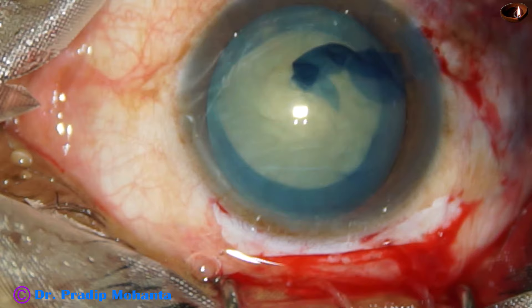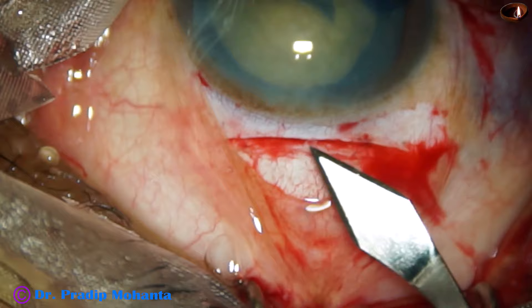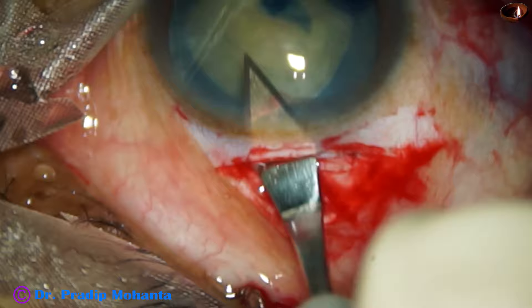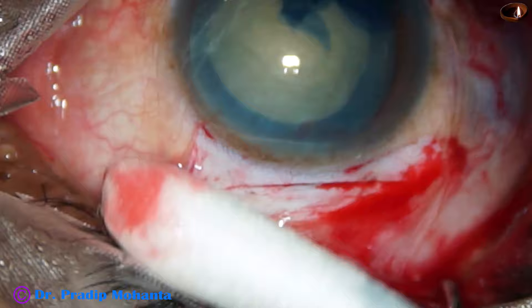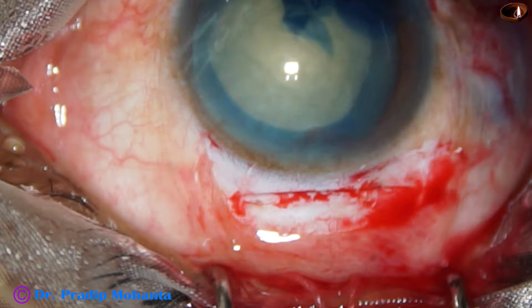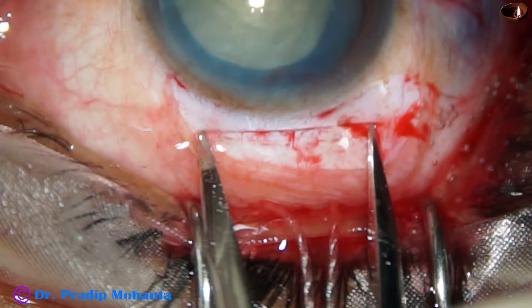Some more viscoelastic is injected and now the tunnel is to be opened. Go to the anterior extreme of the tunnel, then go downward and cut when you go forward. The tunnel is open now. The inner opening is a little larger than the outer opening — the outer opening is about 7 mm and the inner opening is about 8 to 8.5 mm. The main incision width is about 7 mm.